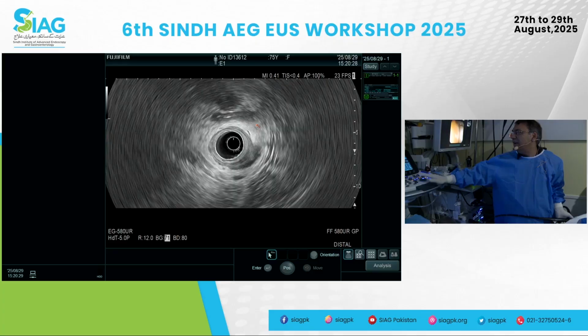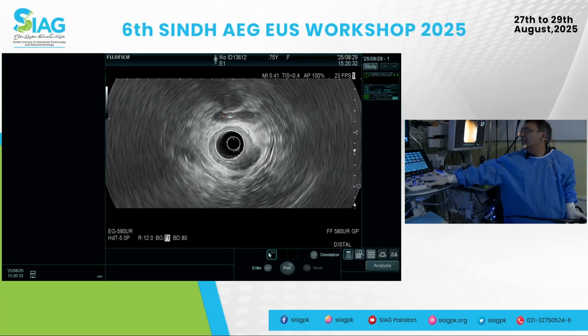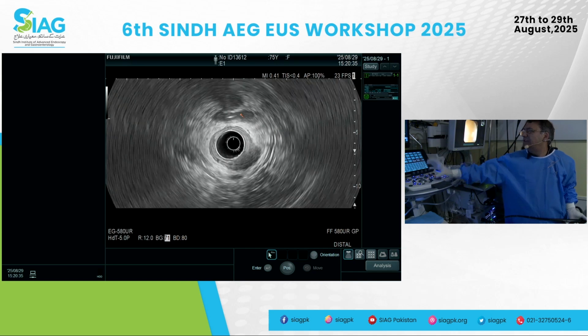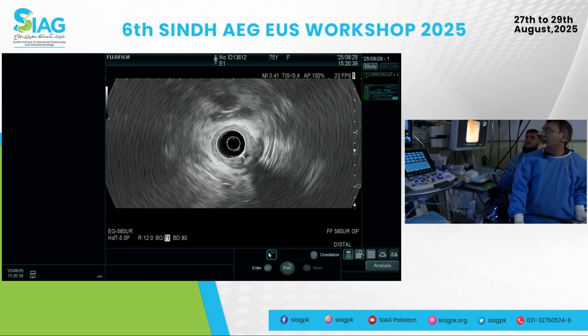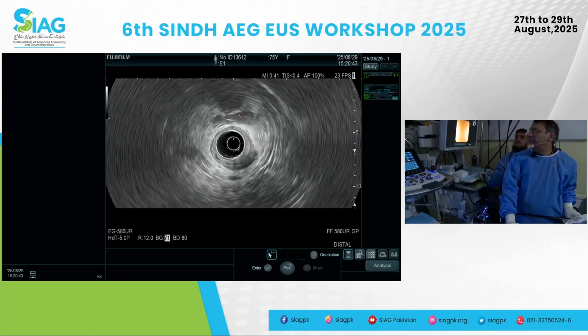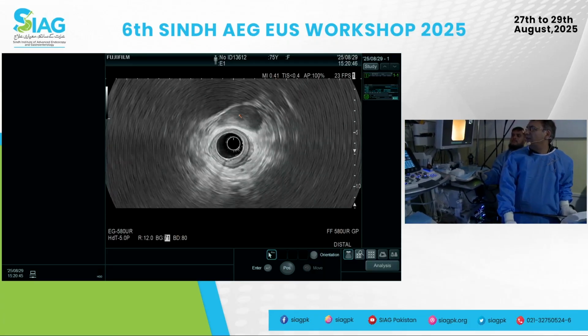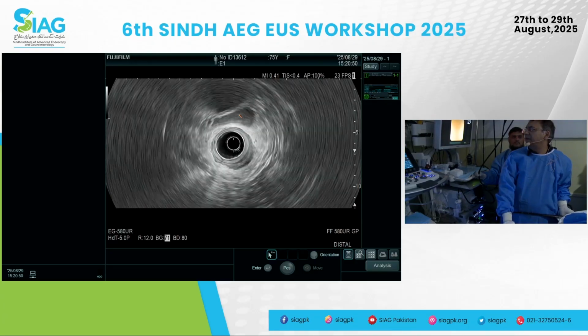You see the air and it gets collapsed. That's the vagina. When it gets to that, it just gets collapsed, and you sometimes see air there as well. So there is a cervix there and the bladder above that. I'll keep coming back.